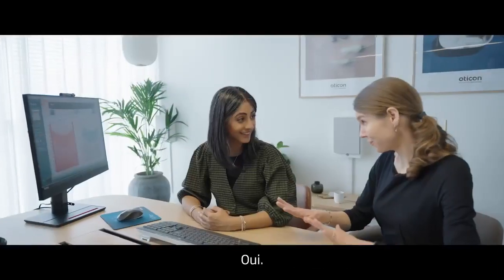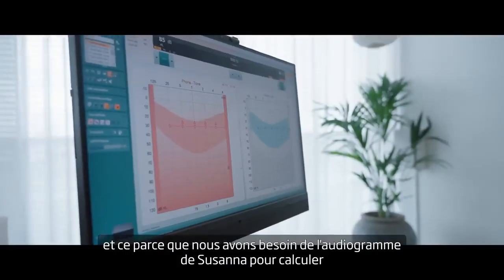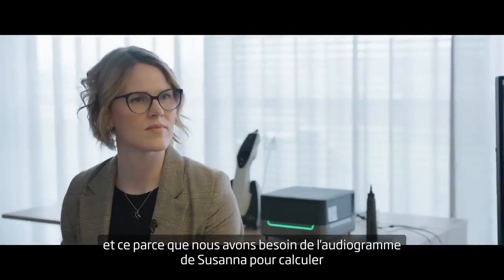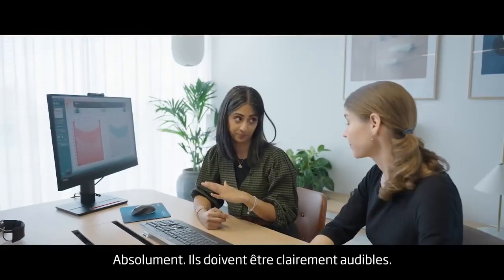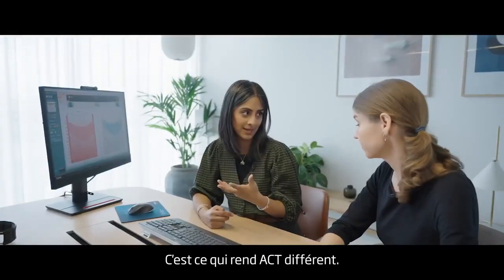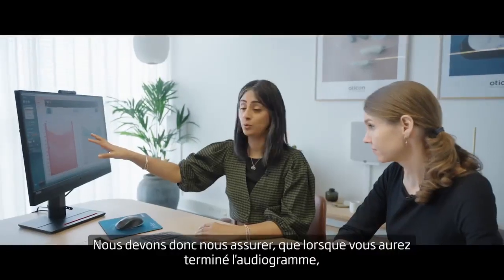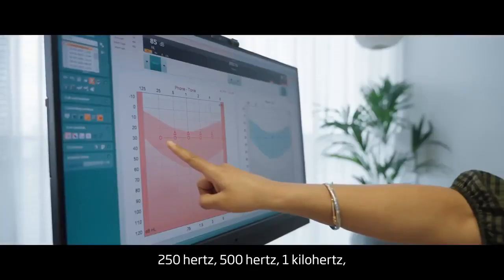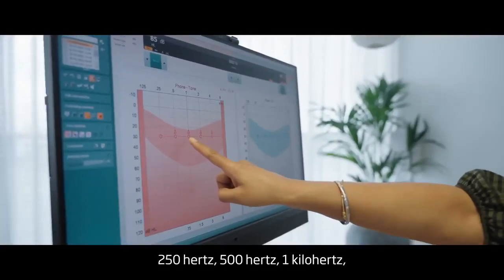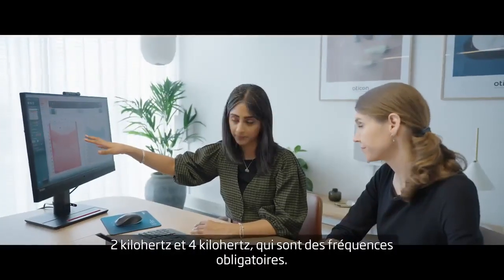Okay, so we're ready to go? Yes. And I can see that you have the audiogram on the screen there, and that's because we need Susanna's audiogram in order to calculate that the levels she's hearing are appropriate for her. Absolutely, they need to be clearly audible. That's what makes ACT different. So we need to ensure that when you complete the audiogram, you have stored thresholds at 250 hertz, 500 hertz, 1 kilohertz, 2 kilohertz, and 4 kilohertz. Those are the mandatory frequencies.